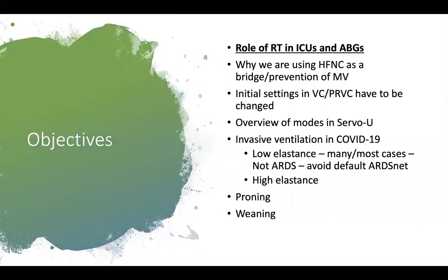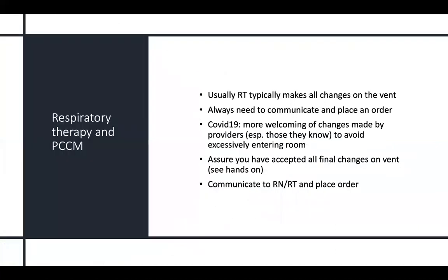I'll start with interactions with the RT in the ICU, since they don't exist in the OR. It's usually the RTs that are making all the changes on the ventilator.